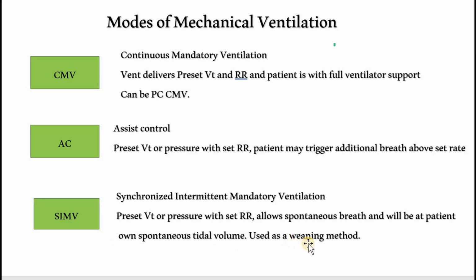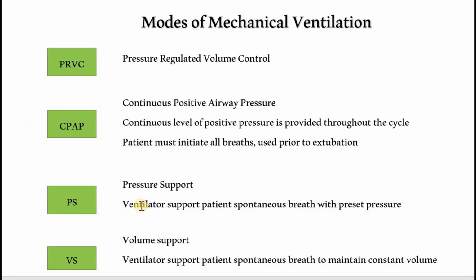And this is used as one of the common weaning modes of mechanical ventilation. Another mode is PRVC, that is pressure regulated volume control. In pressure regulated volume control, pressure is regulated along with a set tidal volume delivered to the patient.